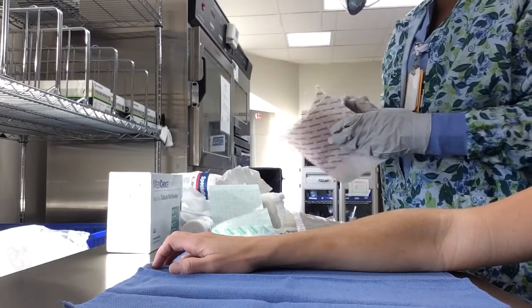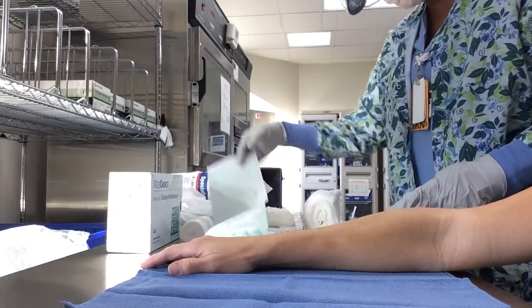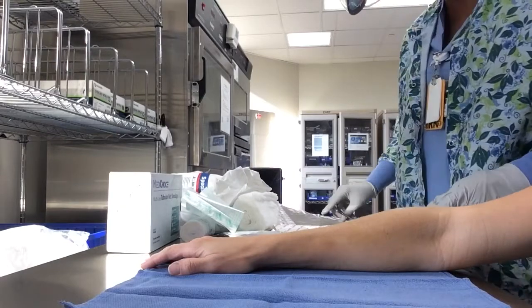This is Mepilex Lite. It is a silicone foam dressing. You will cut it to the size that you need, just a little bit past the wound edge.